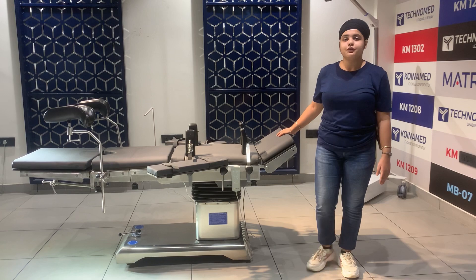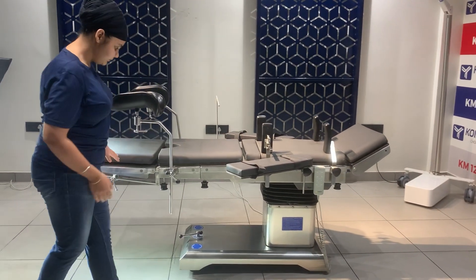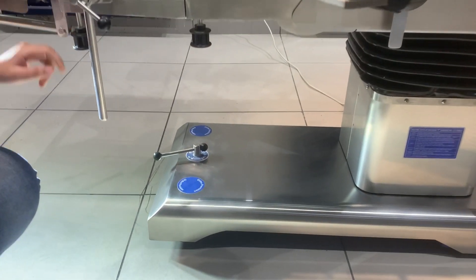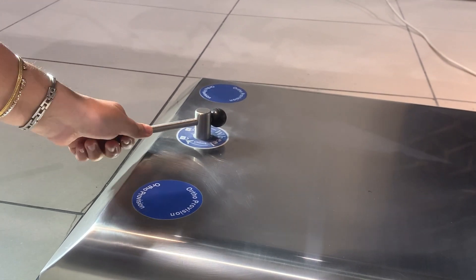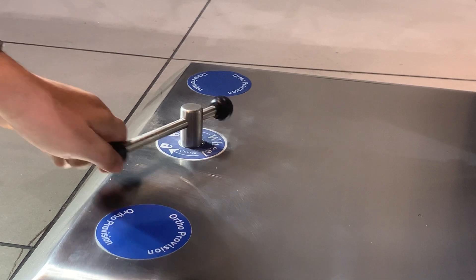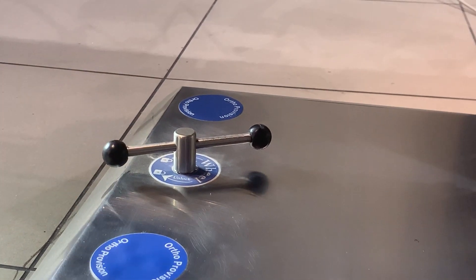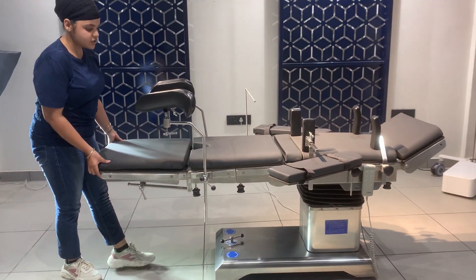We have used 304 medical grade stainless steel for the making of this table. On the base of the table, we have provided an ortho provision and also a manual floor locking mechanism. By rotating this knob you can easily lock the table. Now the table is locked and it's not moving.